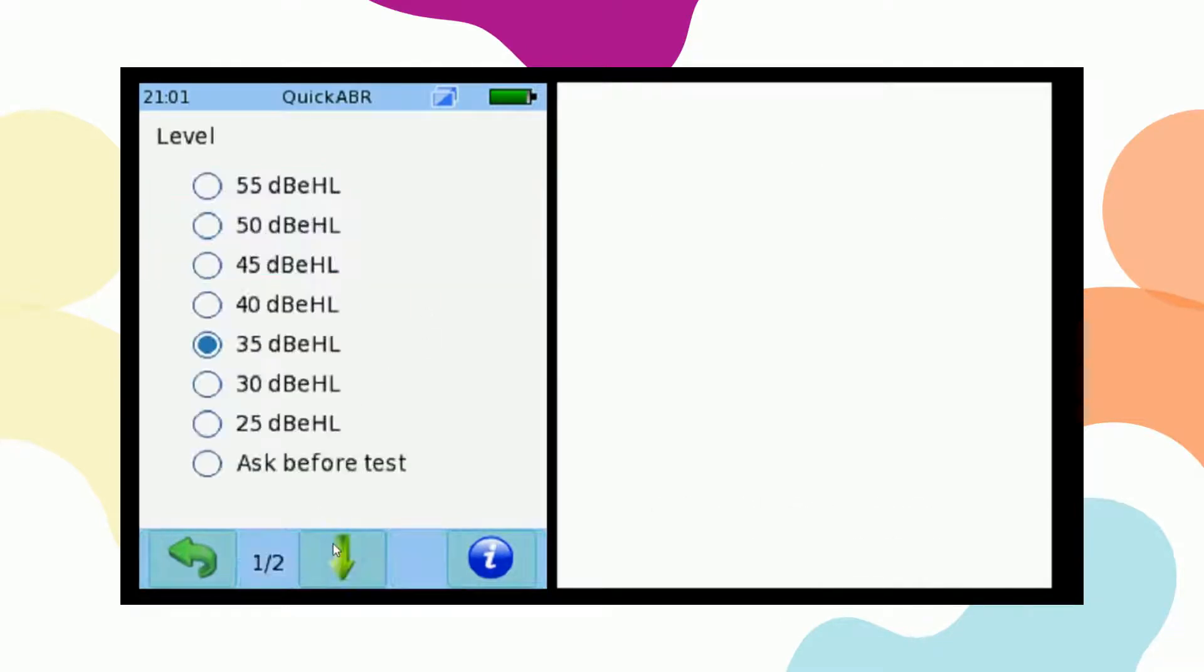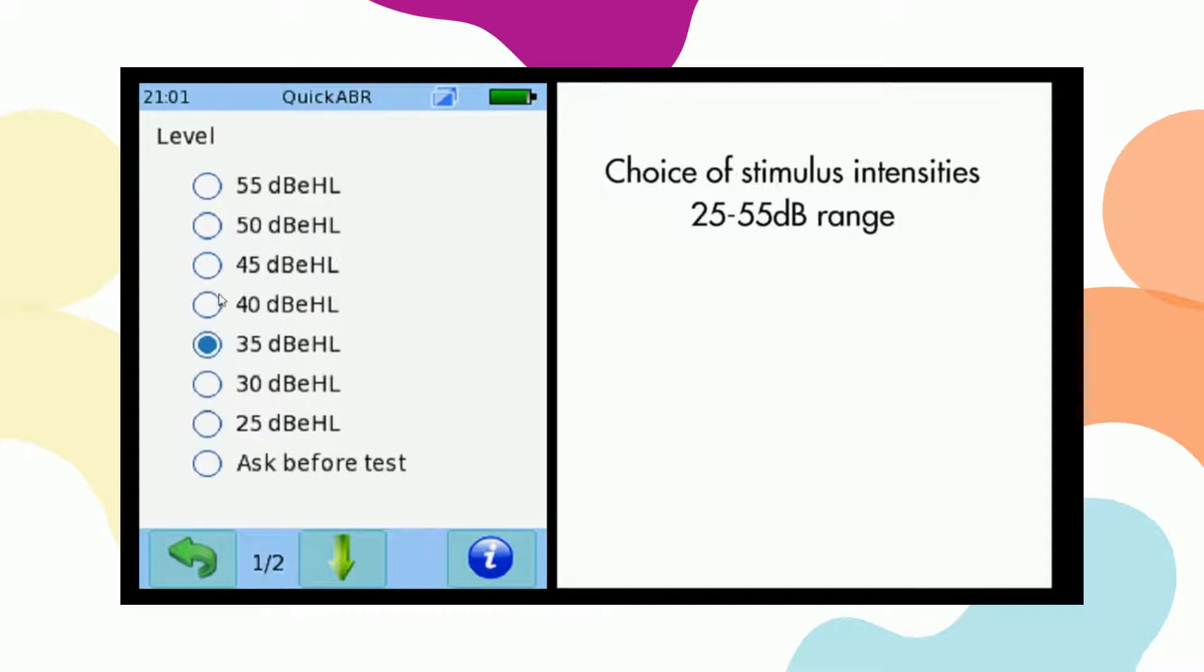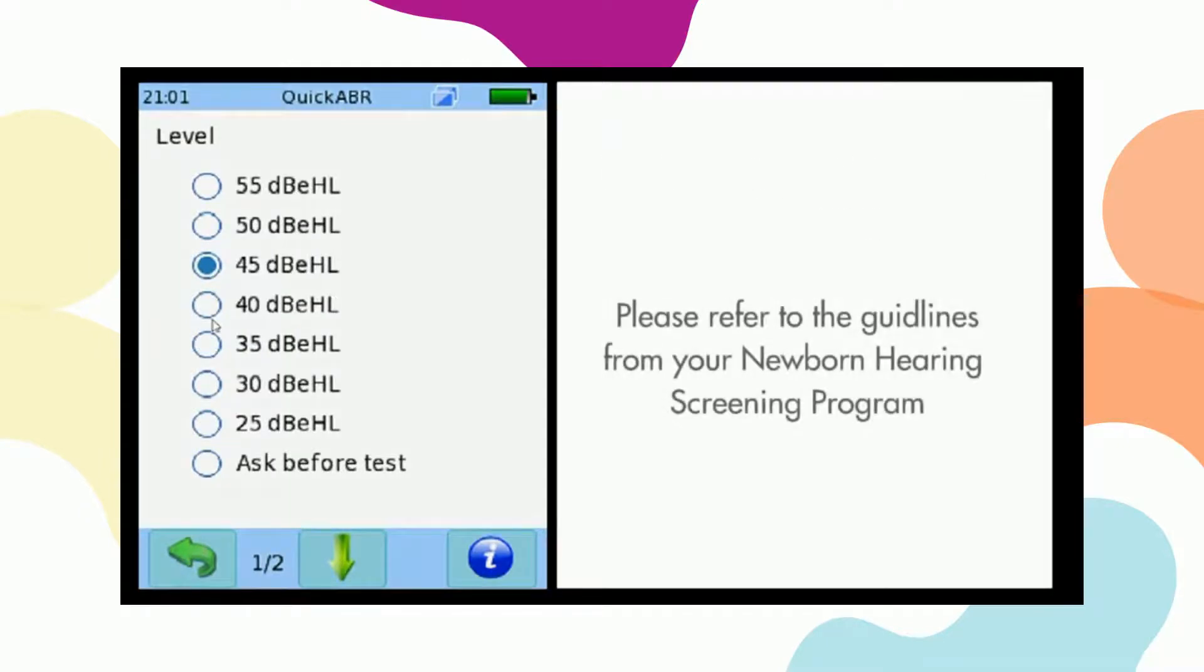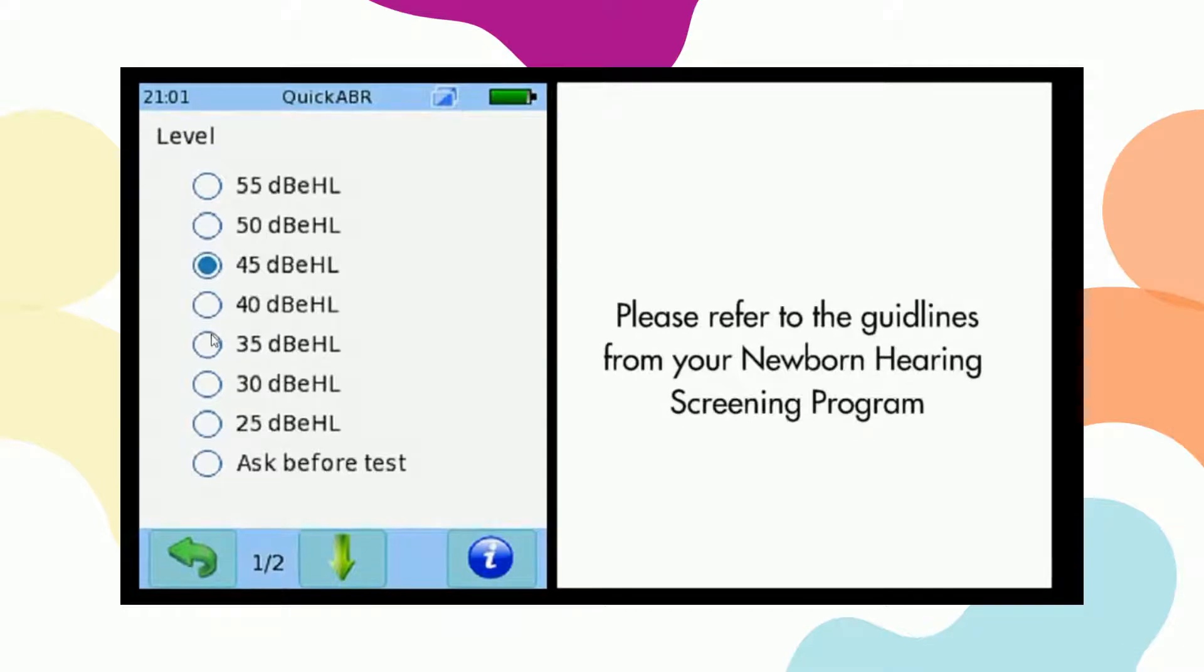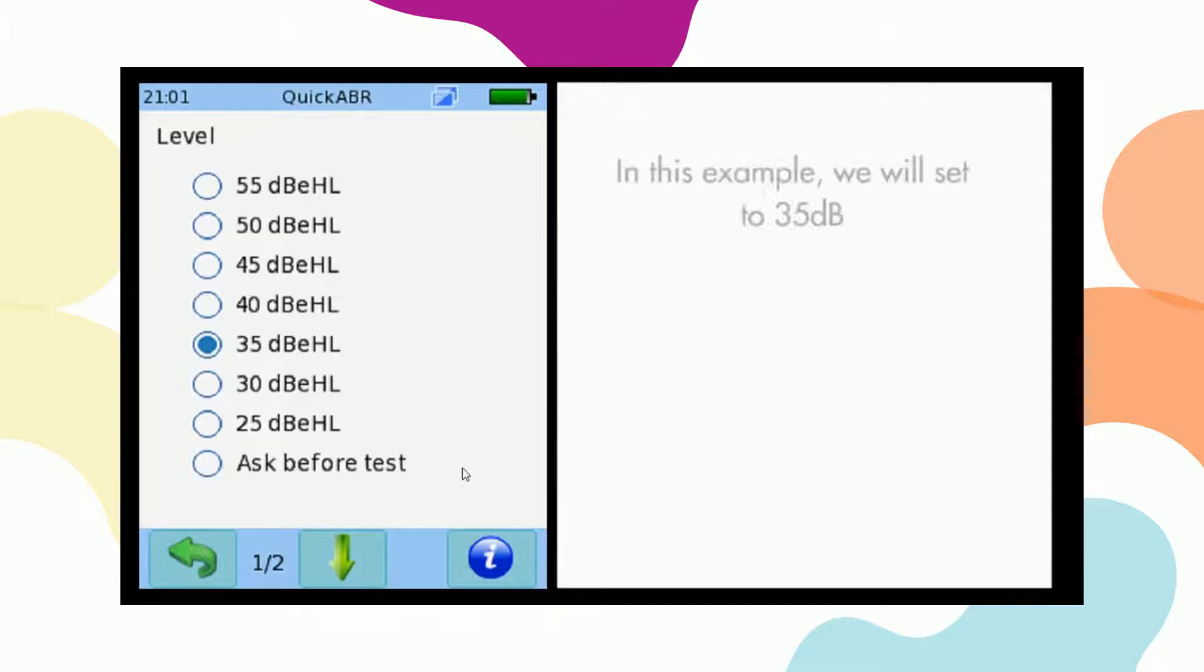Here we can select the stimulus intensity from 25 to 55 dB. Please refer to your guidelines from your newborn hearing screening program for the correct stimulus intensity. For this example we'll use 35 dB.